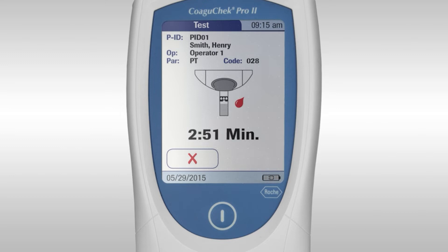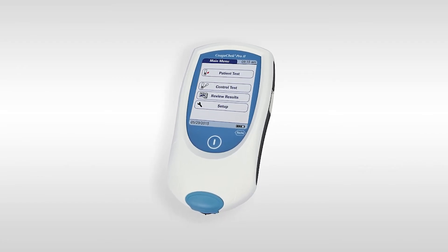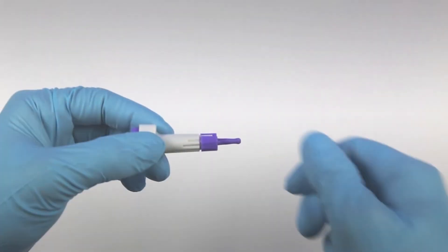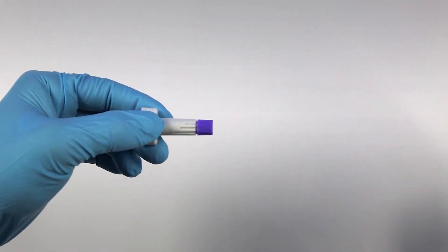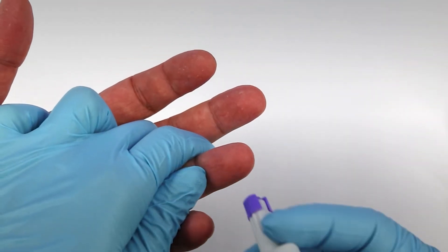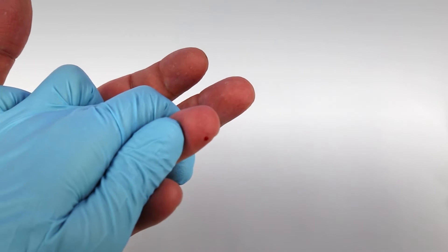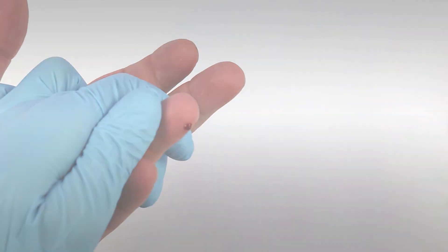Prior to lancing the finger, please ensure that it is clean and dry. Wash the finger with soap and warm water and dry thoroughly. Take an Accu-Chek Safety Pro lancing device and remove the sterile cap. You can adjust the depth setting by twisting the end. Firmly press the lancet to the side of the finger — avoid lancing the tip, pad or knuckle. Massage the finger gently until a drop of blood is formed, but please do not squeeze.